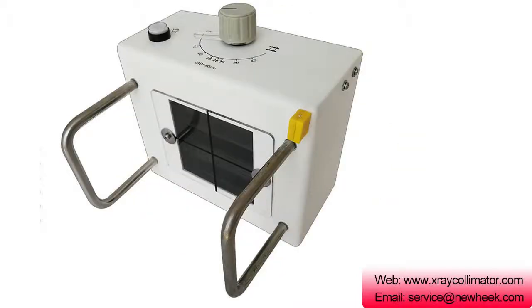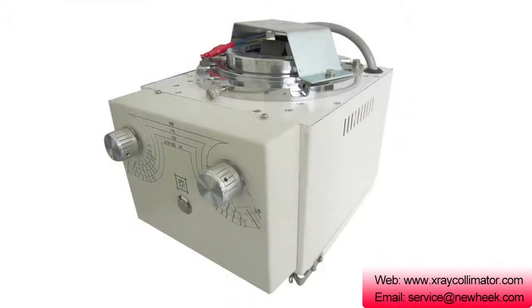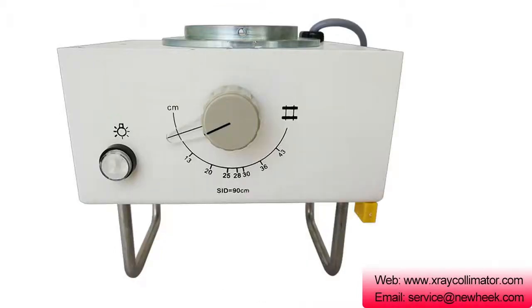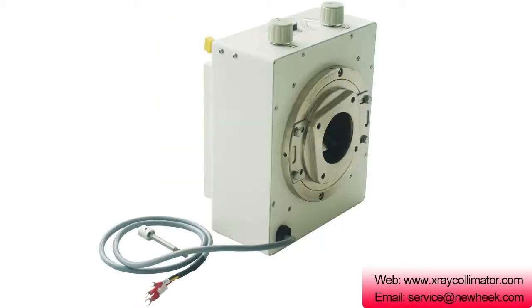The required radiation field area is controlled by the diaphragm. The lower part of the collimator is kept at a certain distance from the skin, and the danger of the patient being squeezed by pressure is greatly reduced. In order to reduce the weight of the collimator, the upper and lower pairs of secondary collimators in the radiation head are usually used for preliminary collimation.